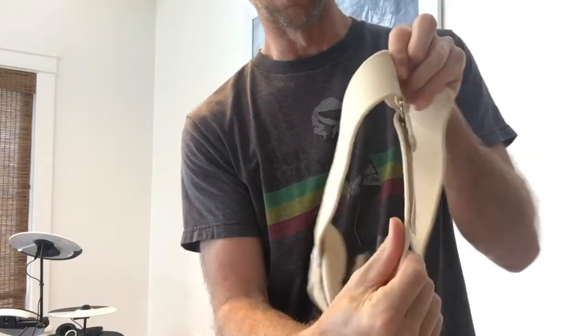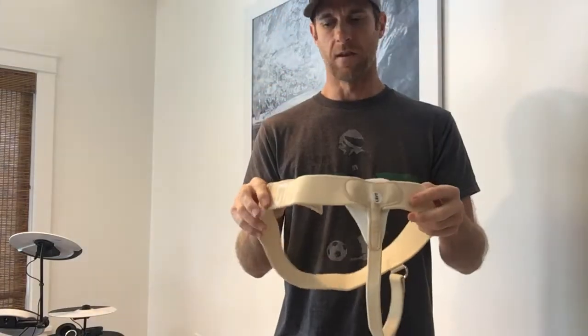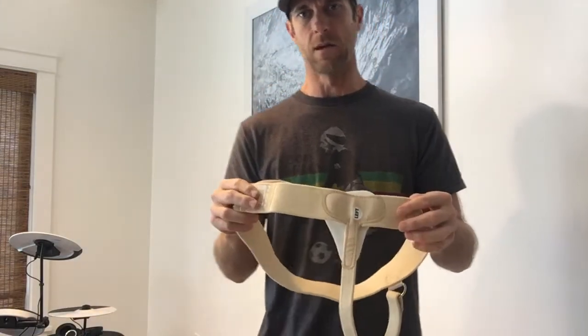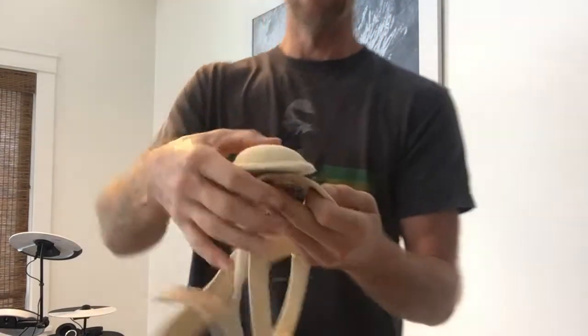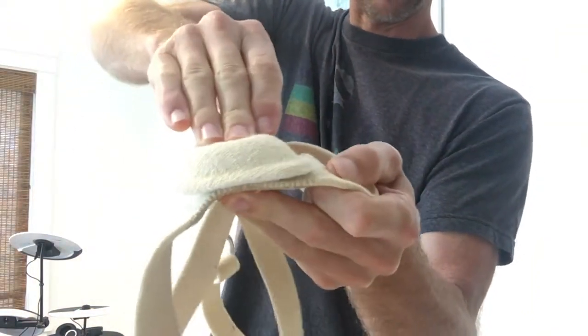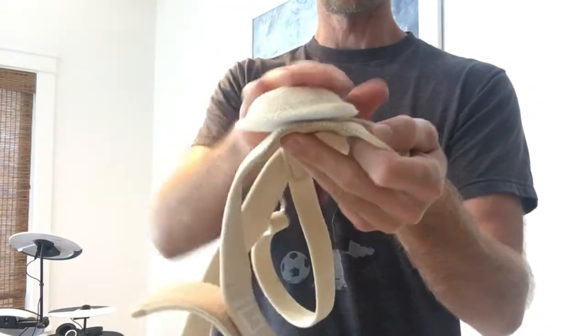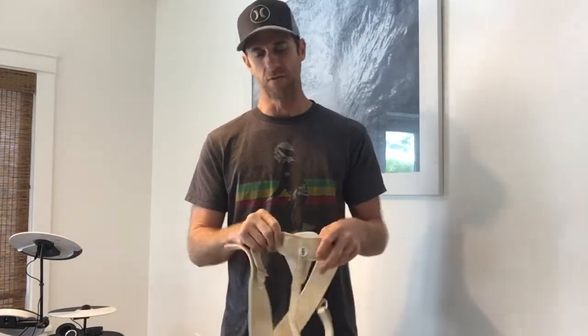For me, this is another one that I had to take off right away because this pad is really hard — it's not squishy at all. You can see I'm pushing pretty hard on it and it barely moves at all. So that convex pad was really pushing into my hernia and it was really uncomfortable really fast.